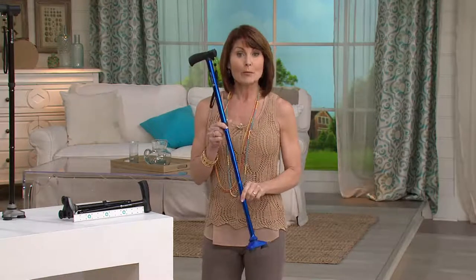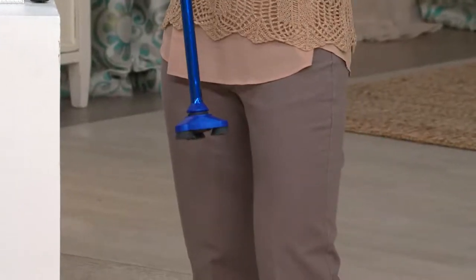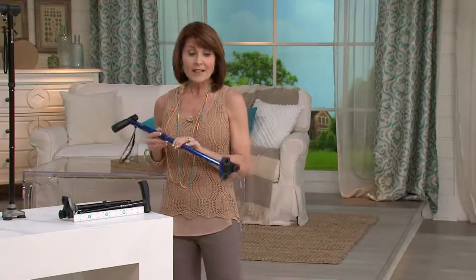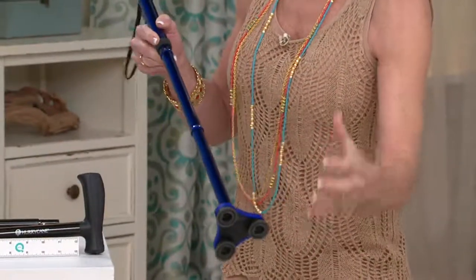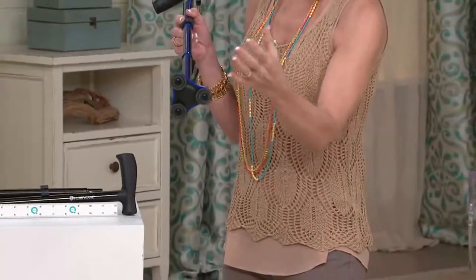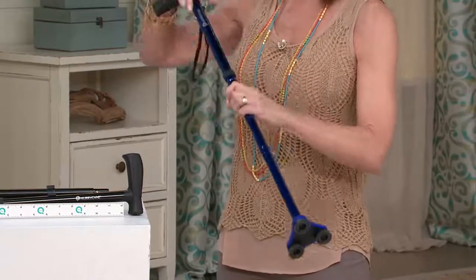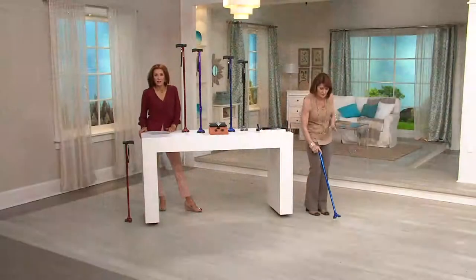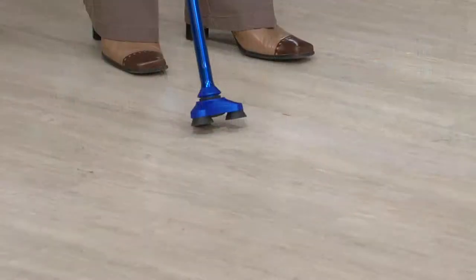The HurryCane — the people who made it studied physics, physiology, the science of how the human body moves. Those three points of contact give you three options for stability on the ground. This base is constructed onto the cane — it's not a part that you slide on. I'm going to demonstrate what the flexibility in this base does and how it mimics the human body's walking motion.